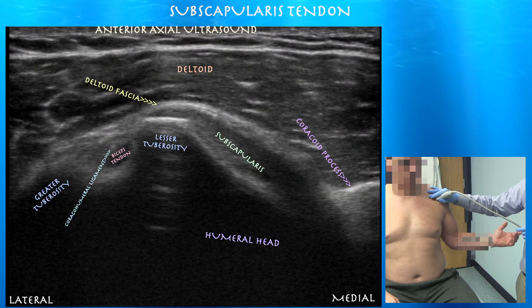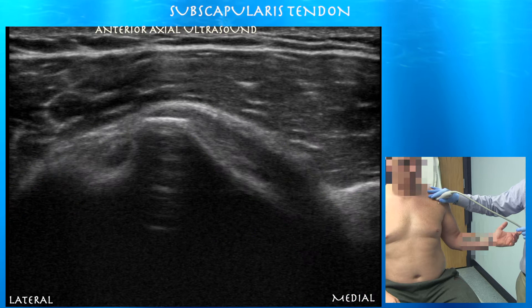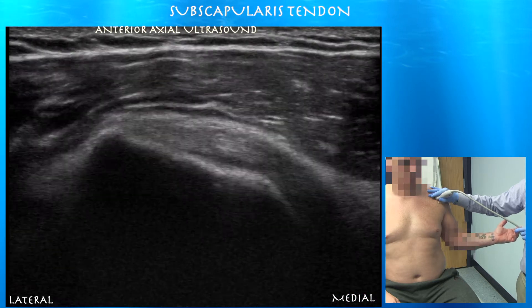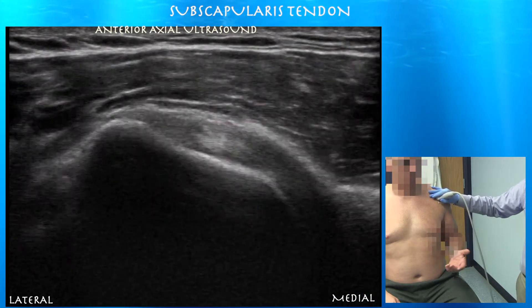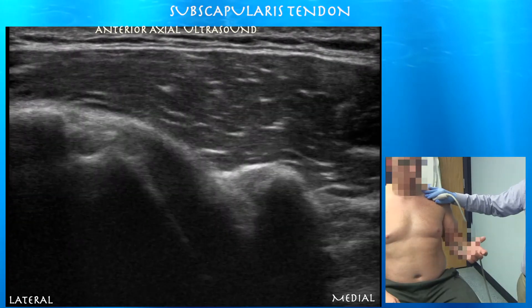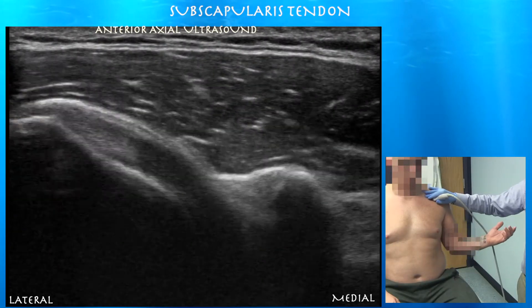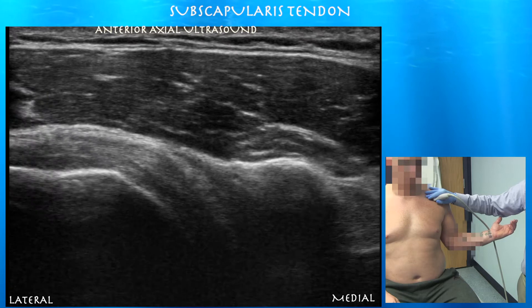Here you can see a little bit of motion of the subscap going underneath the coracoid process. As you externally rotate, you can start seeing the biceps tendon. That's where we see the subscapularis tendon sliding underneath the coracoid process.